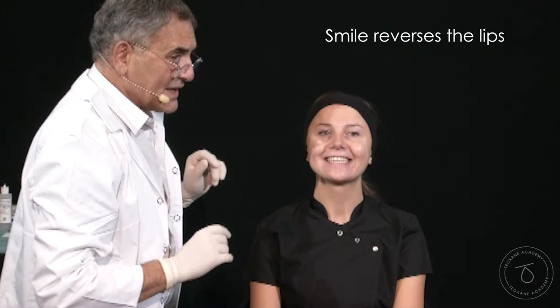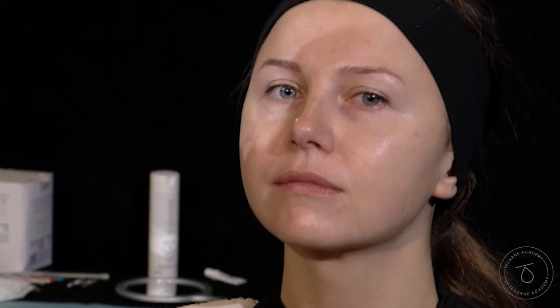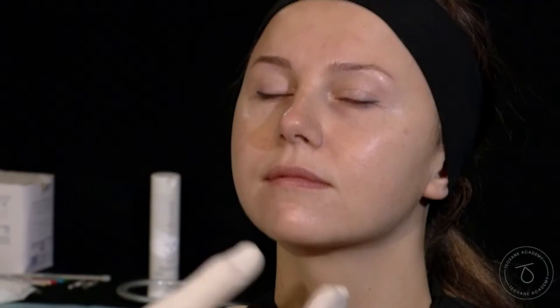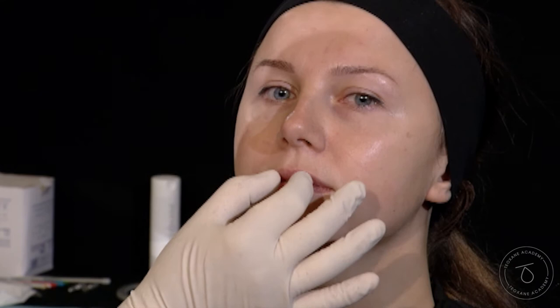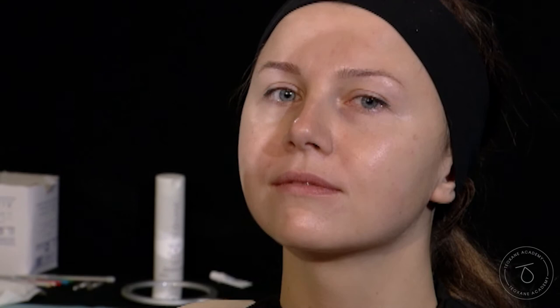So it's a very difficult case, because you will always be betrayed by this. If you just do a filler augmentation — whether you do the outline or you want to plump the red part of the lip — she will be disappointed when she smiles, because whatever you do, however much you put in at rest position, it's going to be lovely, but when she smiles you will always have this reversing problem. So you're going to lose half, at least, of the lip augmentation.